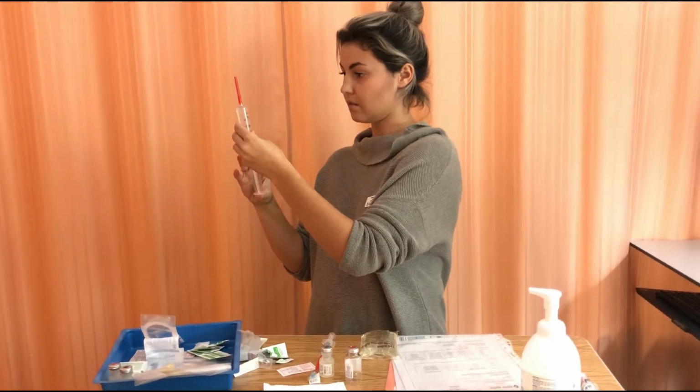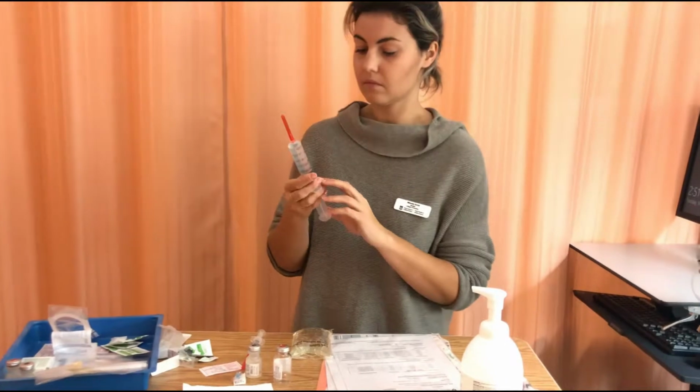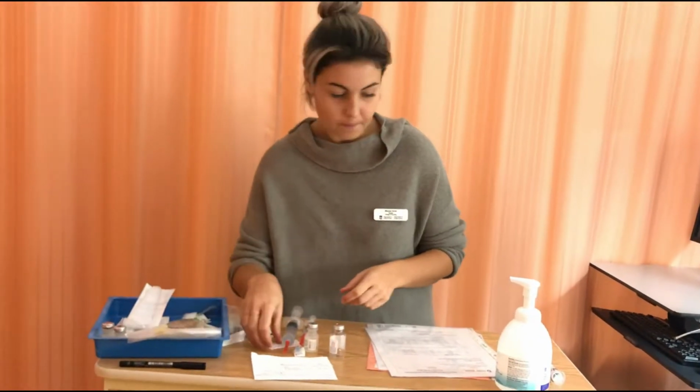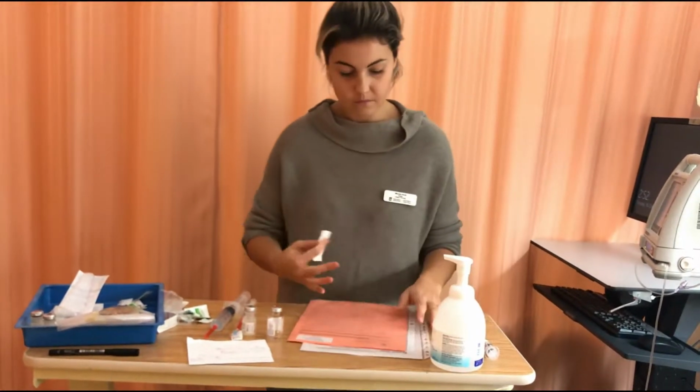Okay. Your IV site as well. So I need 10 ml. Good. There's no redness or swelling. Draw 10 ml of air into the syringe. Today the drug I'm giving you is penicillin. It's an antibiotic. Now I'll be doing my second med check. You might get stomach pain and diarrhea, so just let me know if that happens.